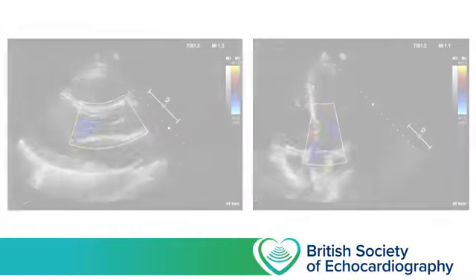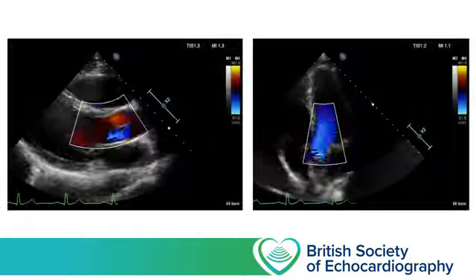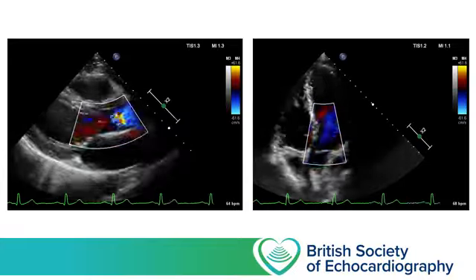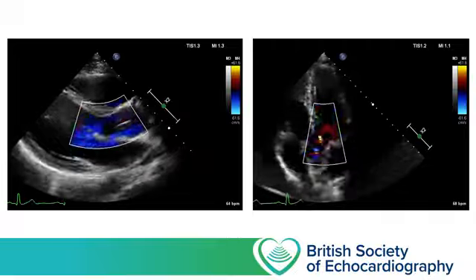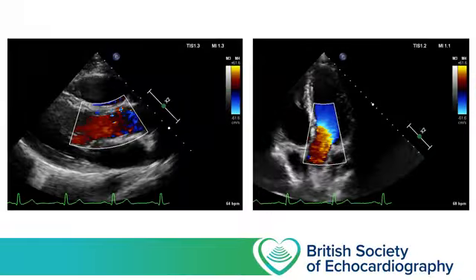So here we have two clips from the same healthy volunteer. On the left a parasternal long axis and on the right an apical 5-chamber view. And in both of these clips we have a colour box over the left ventricle outflow tract, and we can freeze these clips at peak systole to try and visualise the blood leaving the left ventricle heading for the aorta.